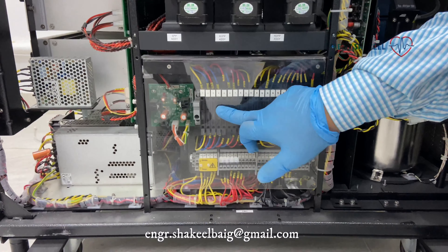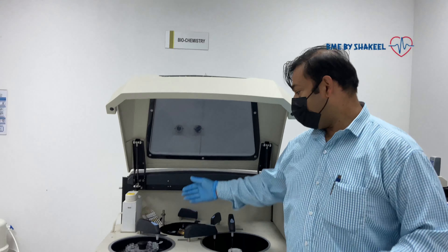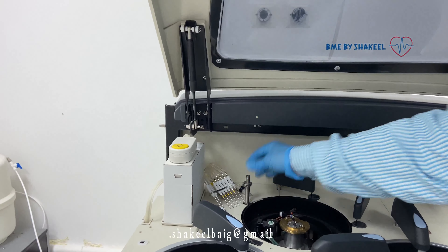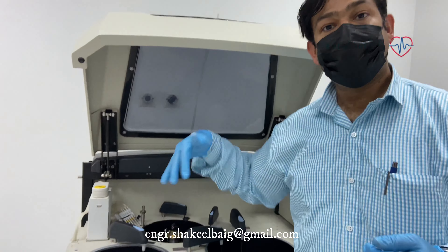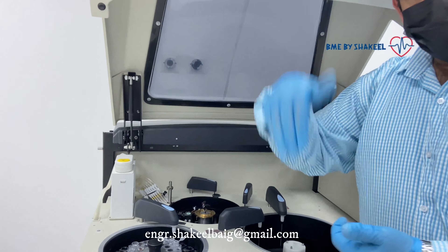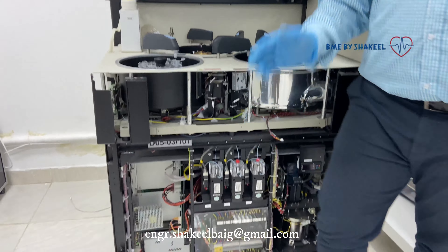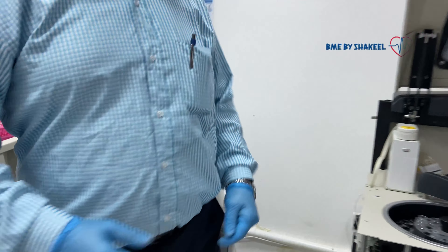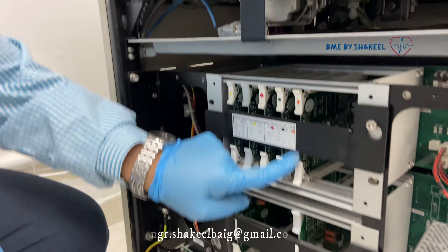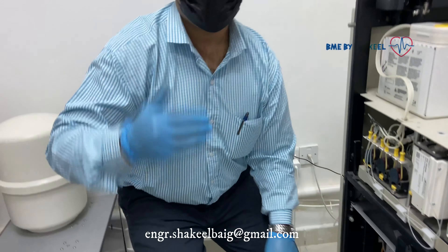The problem was in fuse number three and four. Whenever you guys face an issue with the up and down movement of the CRU unit, first of all just check the fuses, because the CRU unit was not going down. It could be something disturbing the up and down movement. Also, you can see there are some PCBs here — PCB number five belongs to the CRU up and down movement.